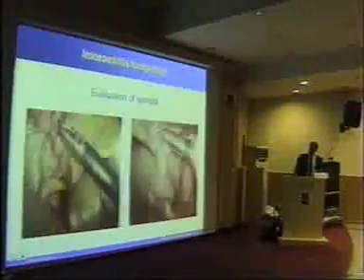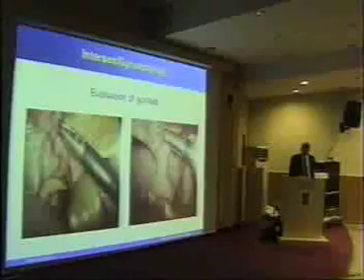We wanted to know whether the intraperitoneal deposits that we could see were actually viable tumour. The tube that you saw actually was the tube from an ordinary laparoscopic instrument, and down it I placed a flexible biopsy forceps as you'd use in a gastroscope. And that worked quite well, although you can get special biopsy forceps. My principle of using the minimal number of instruments was supported by a little bit of improvisation there.